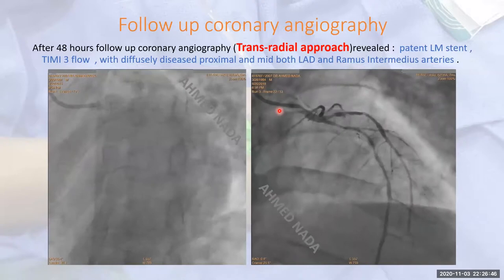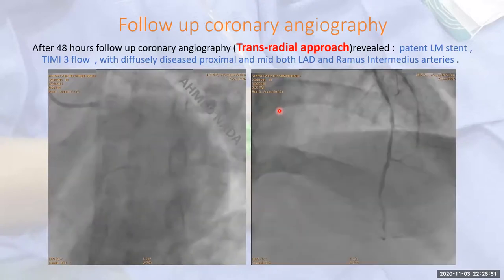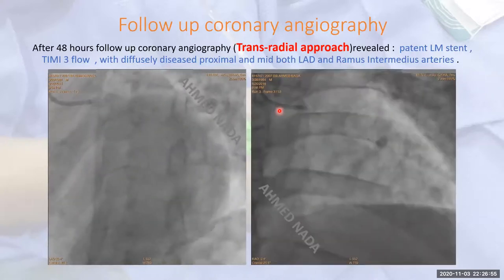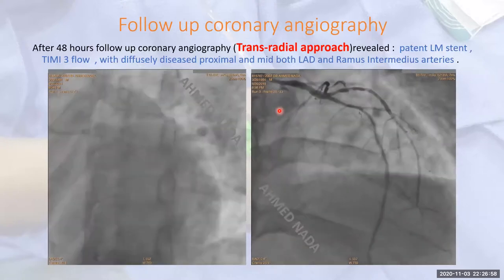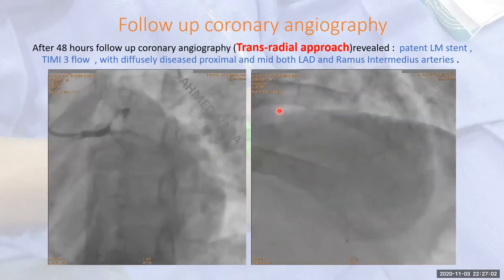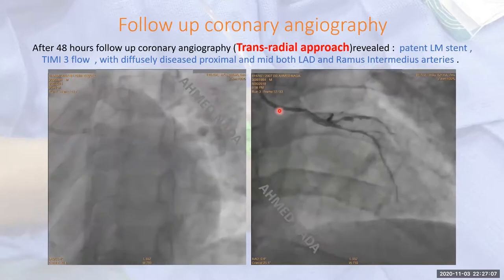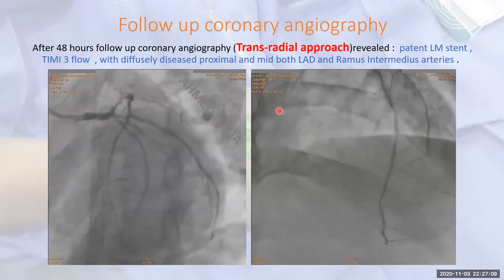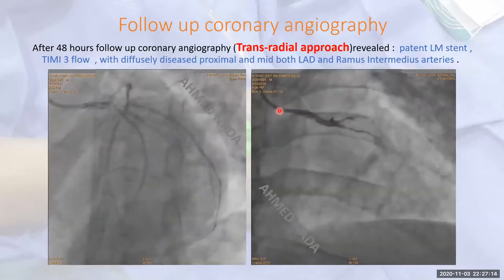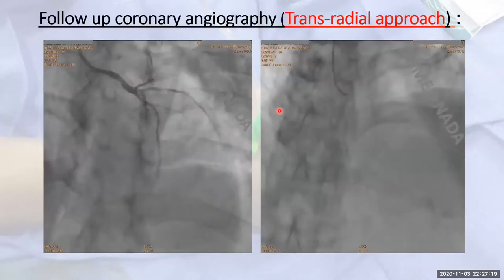Coming again to the presentation, the patient, as mentioned, is diabetic. He has a history of ischemic heart disease. He did PCI to the mid LAD, which clearly has restenosed in that angio. So thinking about putting at least 4 or 5 more stents, we are multiplying the risk of restenosis maybe by 10 or more. So at that moment, we thought that this is enough for the patient. We succeeded in saving his life, and we have to think in the other way.